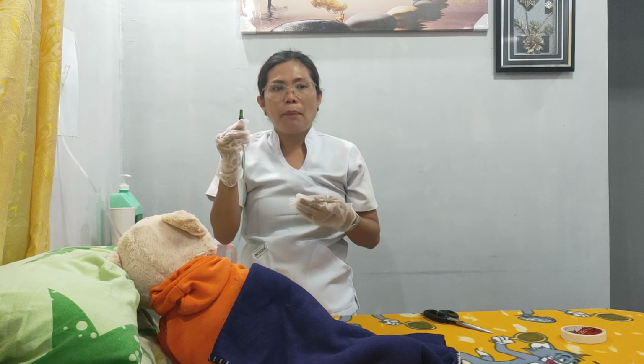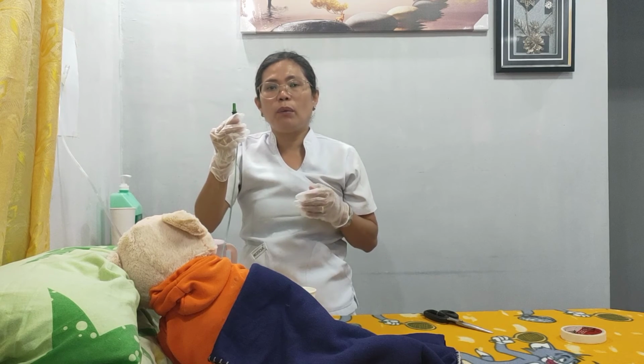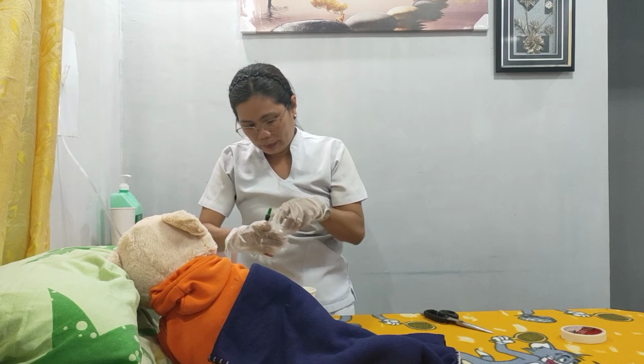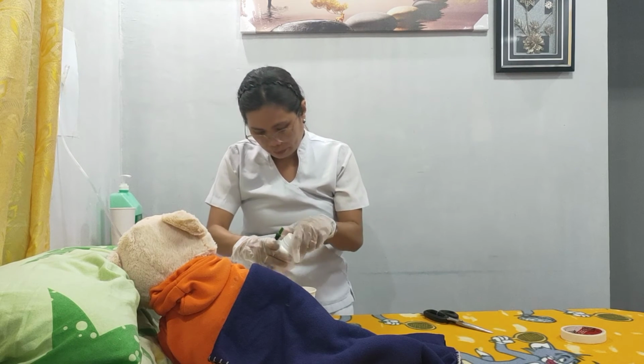When feeding your patient with their medication, you must ensure that the right medication is being prepared. Get a cup and crush the medication finely or dissolve the pills in lukewarm water. After administering the medication, remember to flush the feeding tube with 20 ml of water or as prescribed. Remove the syringe with the stopper and put back the connecting tube into the machine.